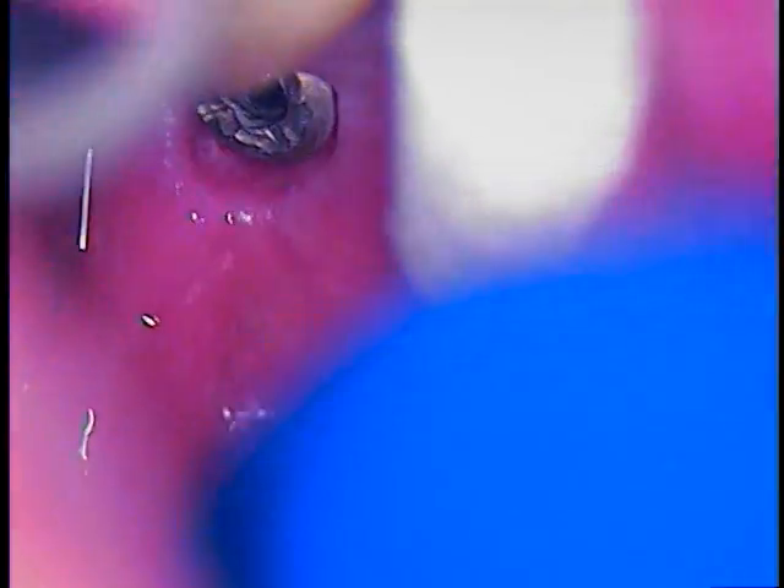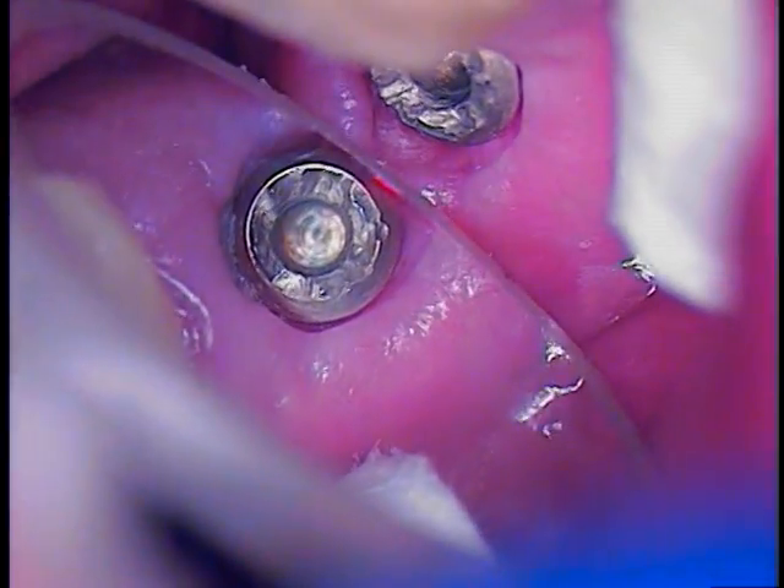Now I'm going to have a close inspection. This is the prior access. Sometimes we'll have a bite block ready for patients to close on. There's a slight angle toward the mesial — more of a mesial tilt. In this case, pre-soaking is pretty much futile, so we have to just go ahead and measure first.